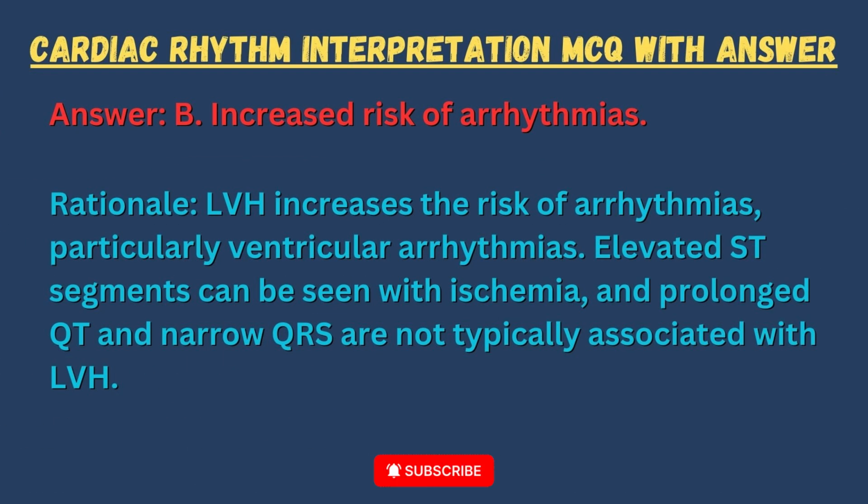Answer: B. Increased risk of arrhythmias. Rationale: LVH increases the risk of arrhythmias, particularly ventricular arrhythmias. Elevated ST segments can be seen with ischemia, and prolonged QT and narrow QRS are not typically associated with LVH.